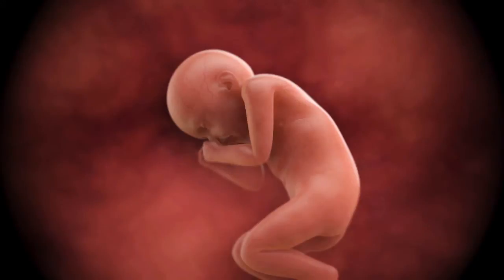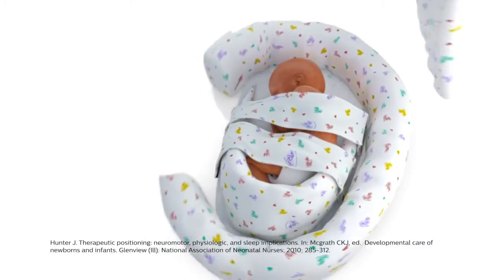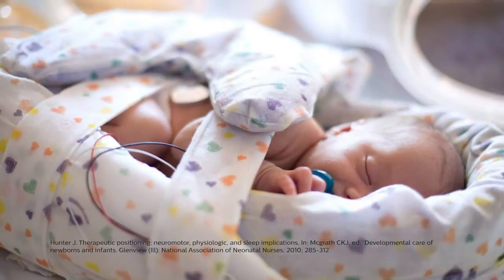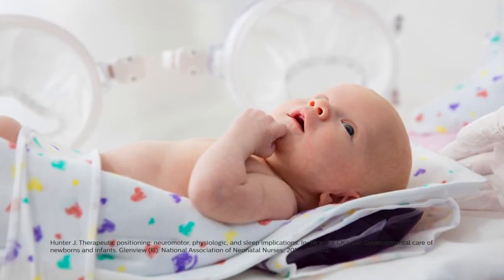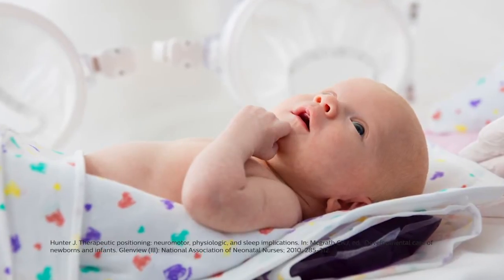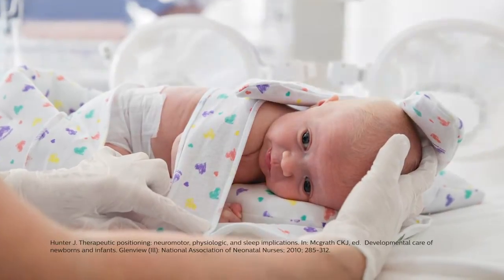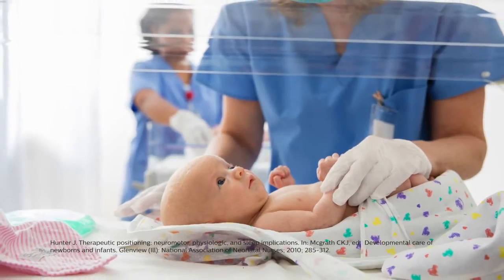In utero, the infant is flexed, midline, and contained with hands to the mouth in a soothing and comforting environment. By utilizing developmentally supportive products like Philips positioning products, the aim is to support the infant in a position similar to that in utero. The immature nervous and musculoskeletal systems are capable of positive or negative outcomes depending on positioning support or lack of support. With the rapid growth of these systems, inattention to alignment can contribute to striking positional deformities in the skull and extremities in a remarkably short time.